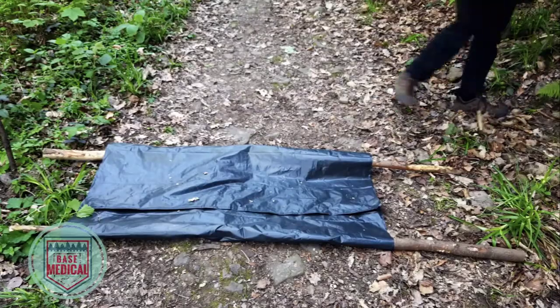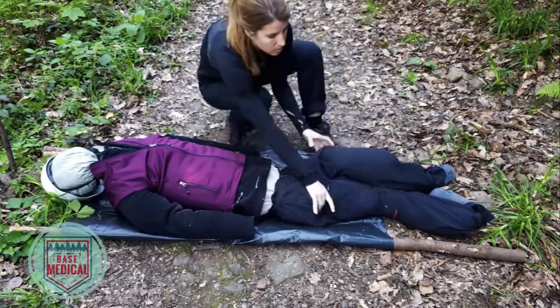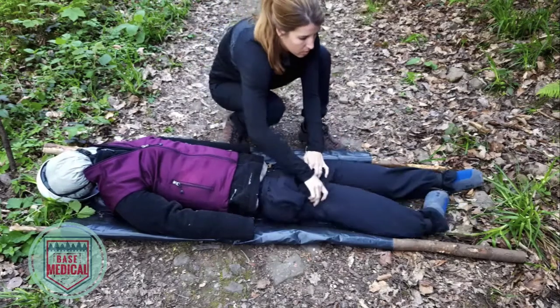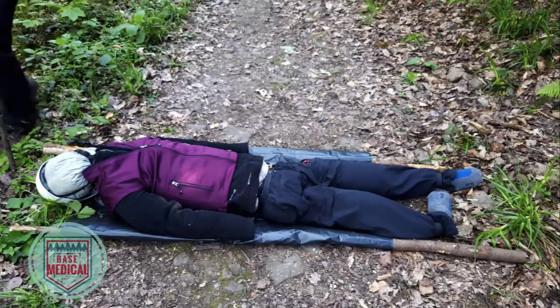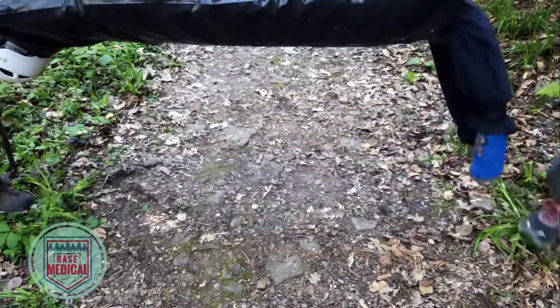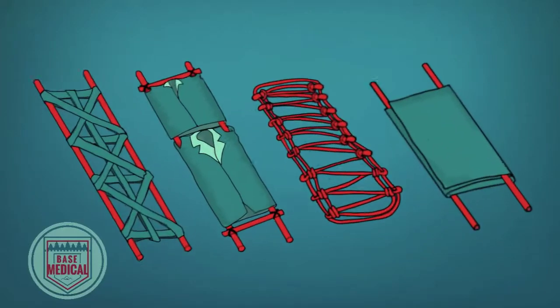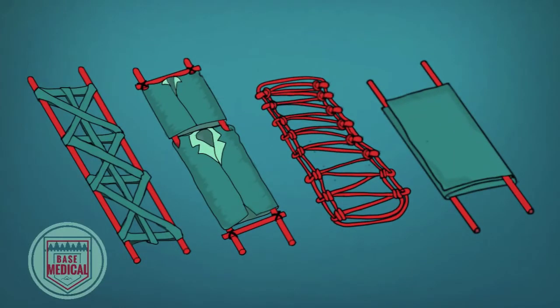This was the fastest of all the stretchers to make and by far the least complicated. We were also surprised with its strength and effectiveness, although we did not test it over long distances. We love how minimal this stretcher is — definitely a favorite.